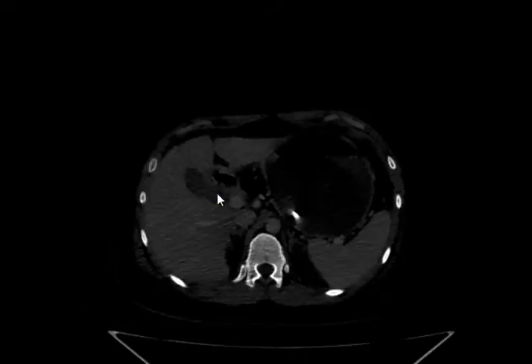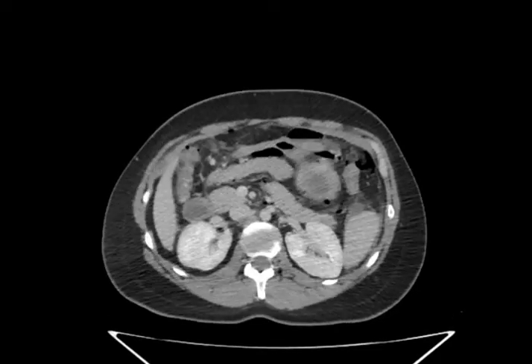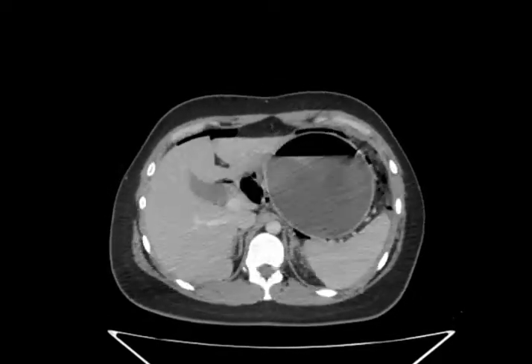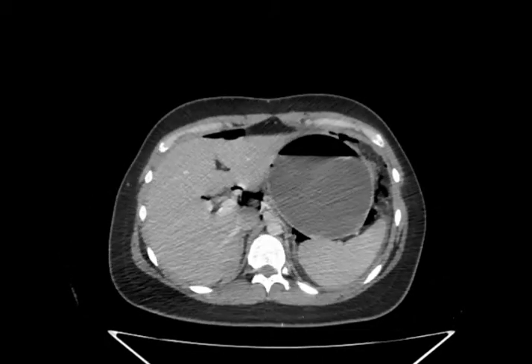The aim of the balloon is to distend the stomach so that any small amount of food will make the stomach full and the patient stop eating or reduce eating. So the trick is the balloon is filling the stomach, maybe a little bit overfull in this case. But you know girls these days, they just want to get thinner no matter what, and she's not very obese by the way.